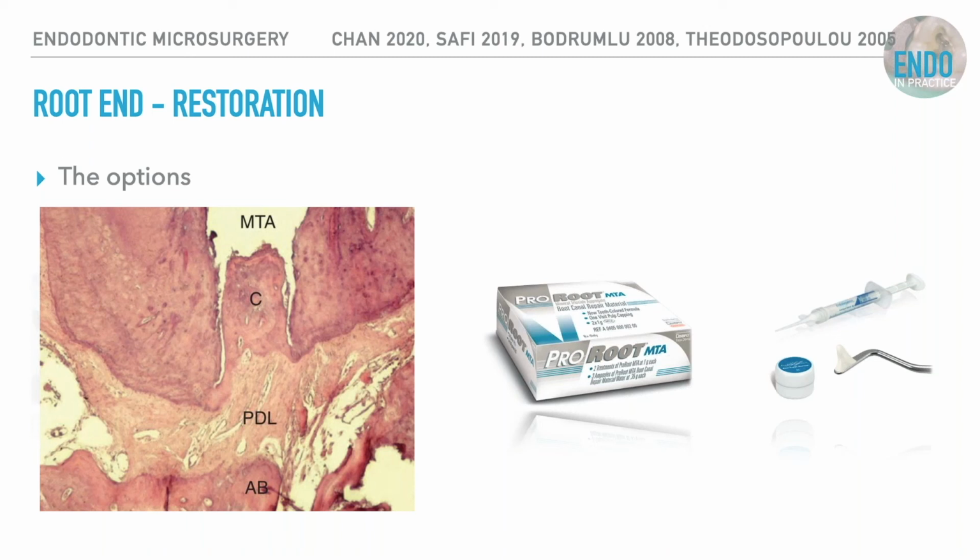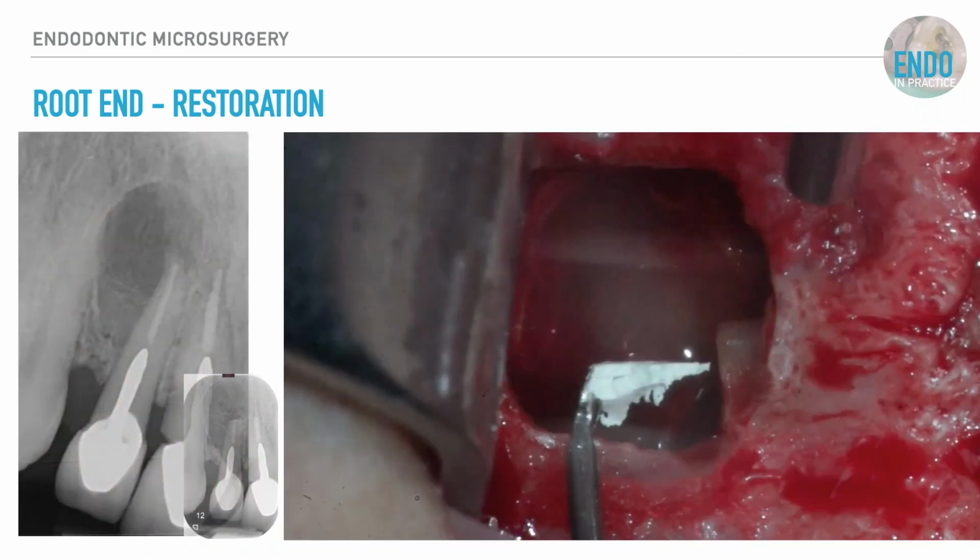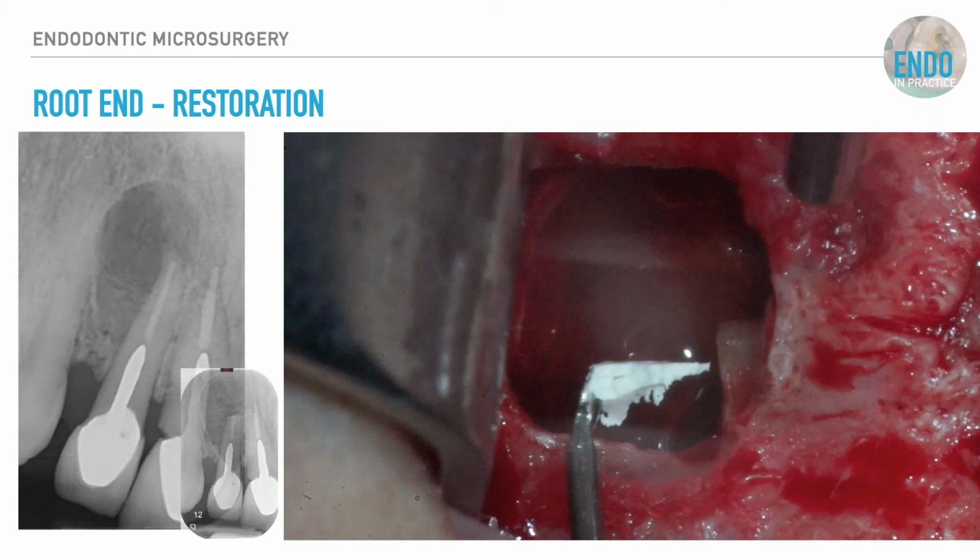Now, a niche bit of info about periradicular surgery and retrograde restorations. Some people are squirting in the sealer and then putting a little lid of ceramic putty on top of it. I don't see the point in that, but you'll maybe see it as an option out there. And just for completeness, when you're using MTA, it needs to be in this consistency to properly pack it, so it needs to stand by itself. It can't be wet.